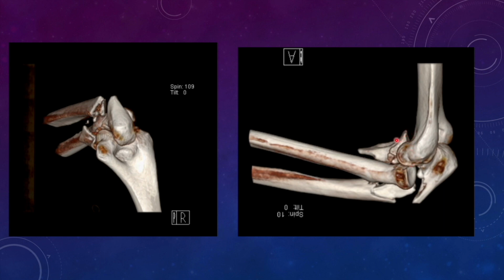And there is a large chunk of the coronoid, you see here, and this part, I've told you, is the supinator crest. It is also fractured. That means this is a kind of avulsion injury of the lateral collateral ligament complex, and probably that is the reason why the radial head and coronoid relation has been disrupted.